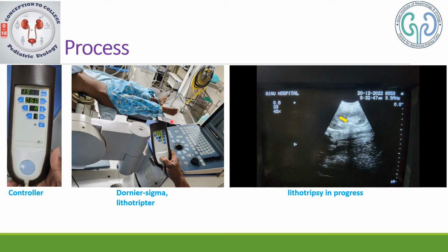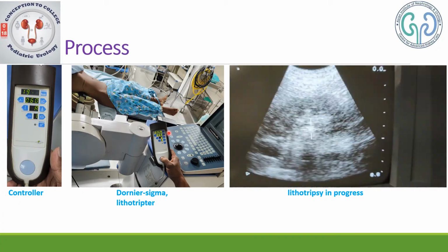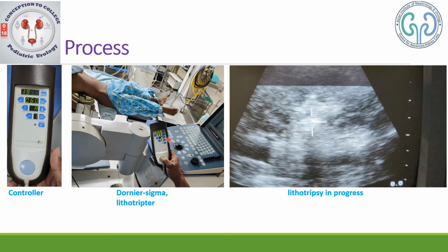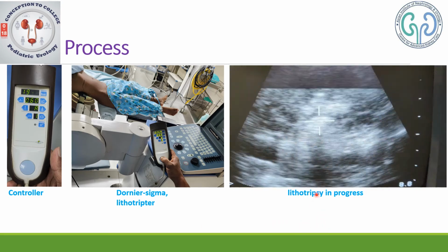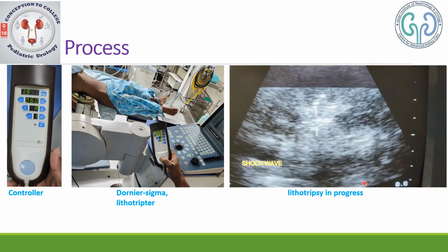If you could actually look at it, we have delivered 269 waves so far with a frequency of 60 per minute, with a medium energy, and the shock wave head being completely inflated. Here you can look at the calculi, and this is how the shock wave is being delivered to the stone. I hope you appreciate the shock wave.